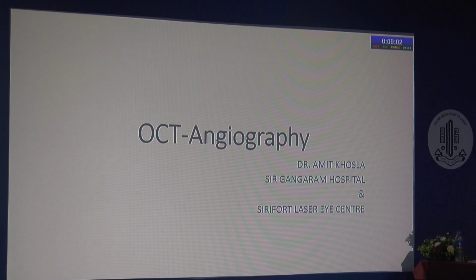So in a premium lens, even a toric, get an OCT done before, because you may have some membrane and the patient will not respond. One of the unhappy patients after cataract surgery is a patient whose OCT hasn't been done. Normally you end up doing an OCT after the surgery; get it done before the surgery if you're doing premium or patient expectancy is higher.